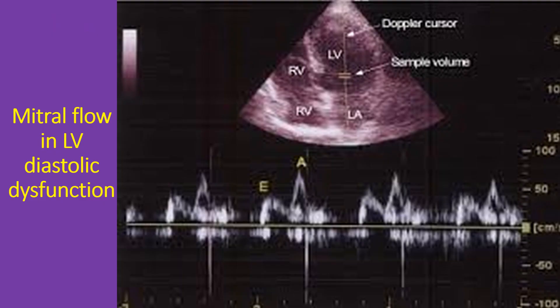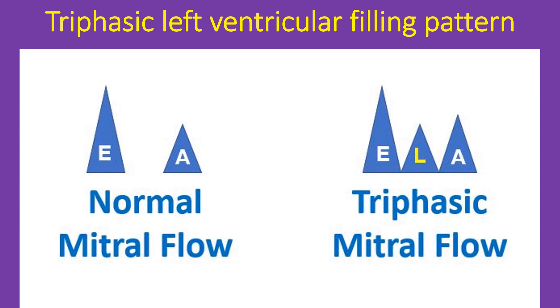The upper half of the image shows the apical 4-chamber view of the heart. The Doppler cursor and the sample volume are seen along the midline of the left ventricle. The lower half shows the Doppler flow pattern across the mitral valve, with the X axis representing time and Y axis representing velocity in centimetres per second. A triphasic left ventricular filling pattern with an additional mid-diastolic wave — called T wave by some and L wave by others — can occur in situations of left ventricular diastolic dysfunction, especially in hypertrophic cardiomyopathy.